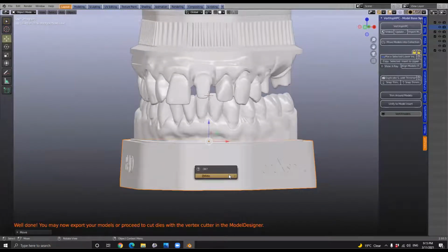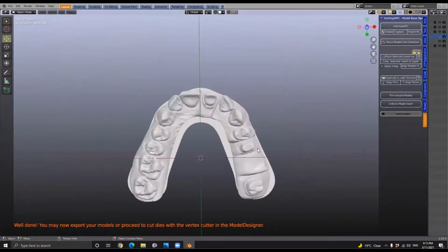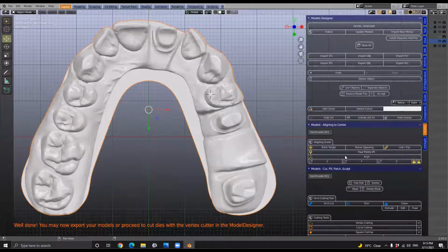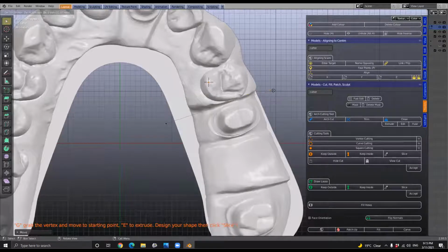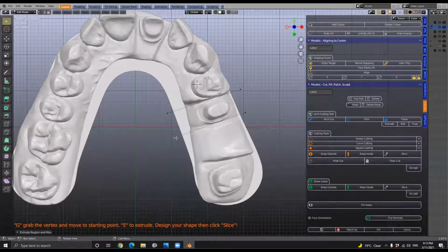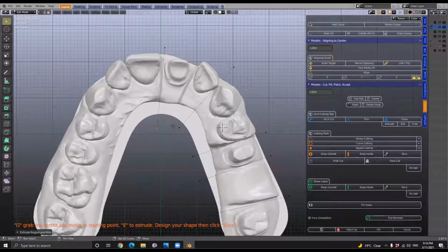All right, so from there we would then cut the model. I'm going to look at it from the bottom upwards, and we're going to place the cursor, and in the model designer, we're going to go to the vertex cutter. So vertex cutter, using the G key and then the E key to extrude like that, and then Shift D, E key, left click, Shift D to duplicate, E key to extrude, and then Shift D again. We can make another one, E key to extrude. It's very, very easy, and it follows the exact same way as using a saw in the dental lab. So Shift D, extrude, and then one more time, Shift D.